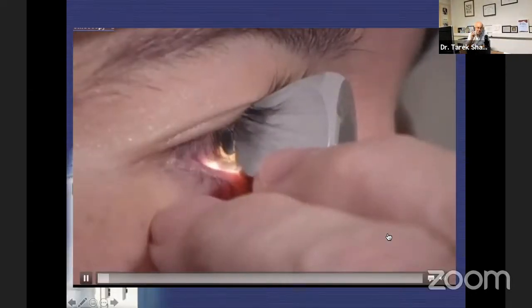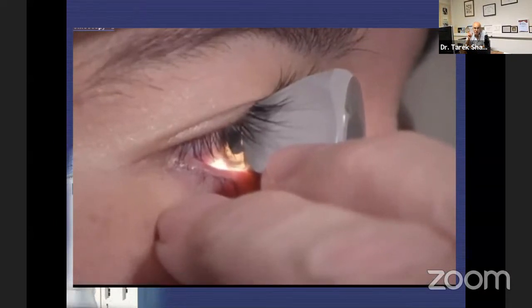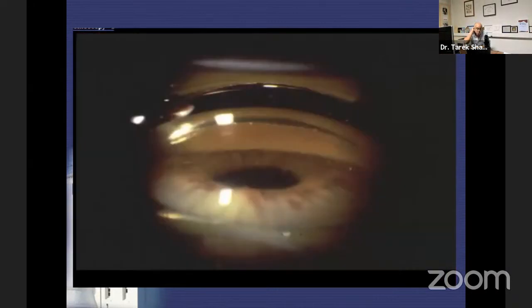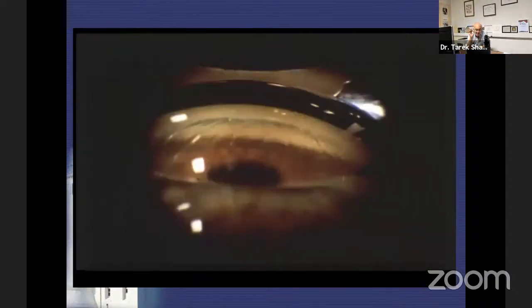Using the four-mirror requires enormous sensitivity in your hands. You are not supposed to push very hard — otherwise the cornea will corrugate and you won't see the angle well. You have to be extremely sensitive to catch and see the trabeculum. With a little bit of pressure we can see the angle deepening and the trabeculum becoming visible.